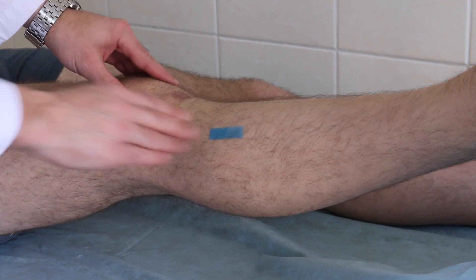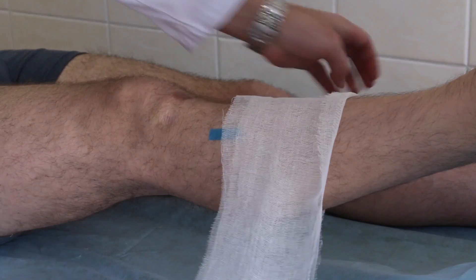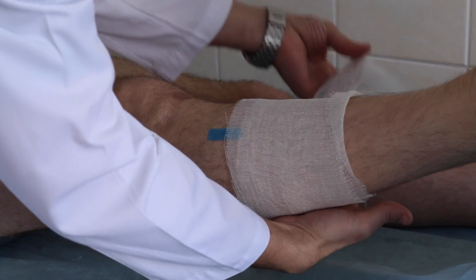In case of venous bleeding, you should apply the tourniquet 2 inches distal to the wound. The procedure of tourniquet application is the same as described earlier.